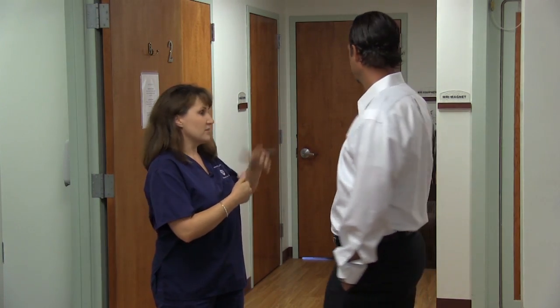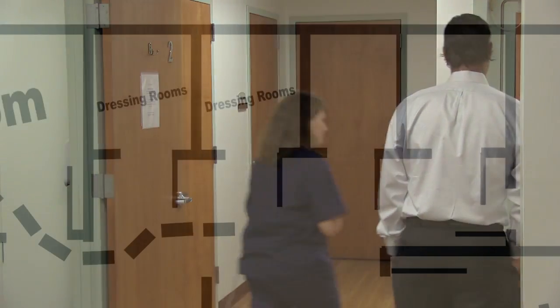Before an exam, though, we need to come to a dressing room here, lock up your wallet, watch, and keys. Awesome. Anything else that we don't want to go into that magnetic field. Like World Series rings? Absolutely. Gotta lock it up, right? Absolutely, that'll be locked up. We always key in on safety here for the magnetic room. So the next step would be to go to the MRI suite. Perfect.